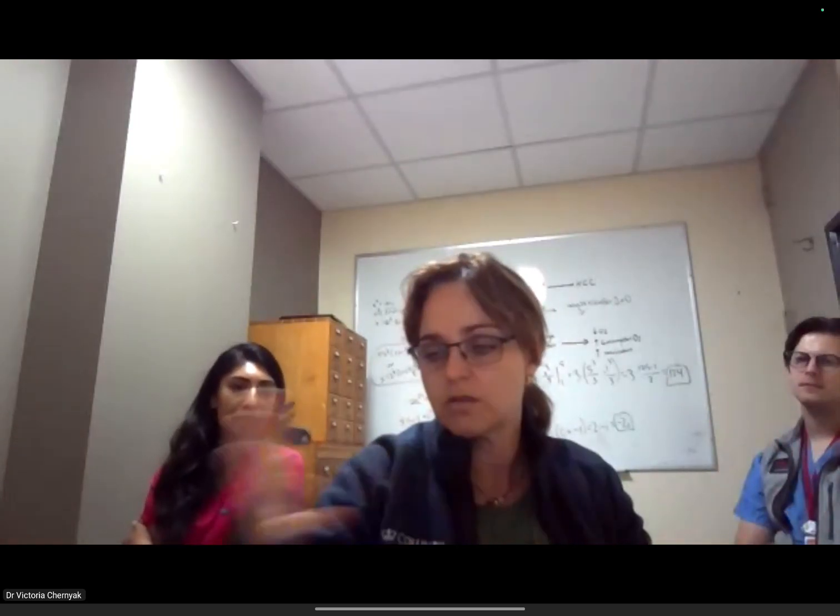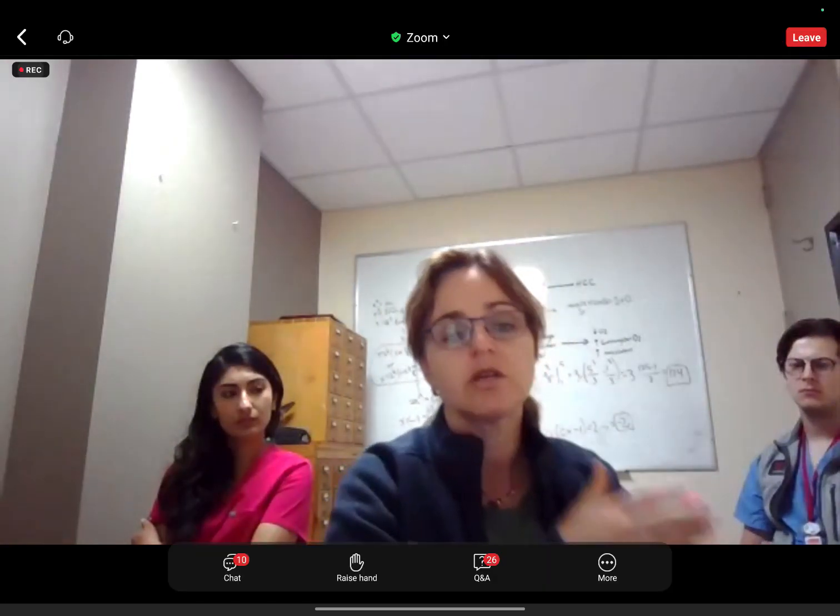Otherwise, I'm not very reliant on the ROI, because when you put the ROI, that number is really subjective and will depend on various things and is not translatable between patients, between scanners. So it's tricky when things are hyperintense on T1. Now that's for arterial phase. For portal venous phase, there's a really nice study that showed that reliance on subtraction images to assess portal venous phase is actually detrimental. So I would probably caution against using portal venous phase subtractions, period.